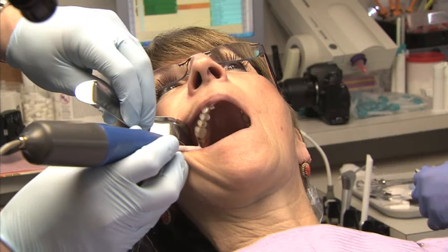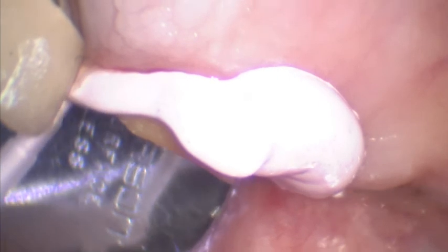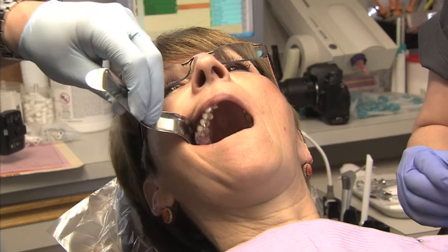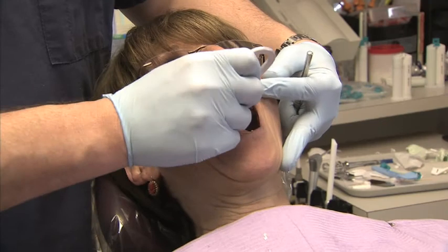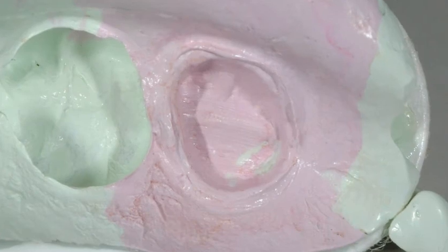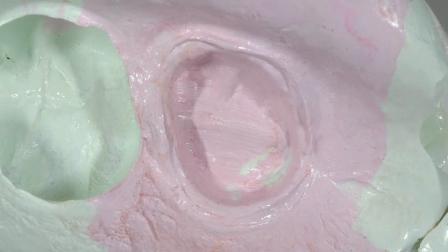New Aquasil Ultra Cordless uses exclusive digit power dispensing technology to precisely place wash material directly into the sulcus in seconds. From its ultra-thin intrasulcular dispenser tip to its super-high tear-strength wash material, Aquasil Ultra Cordless offers you easy, accurate, and detailed margins without having to pack cord or apply retraction paste.